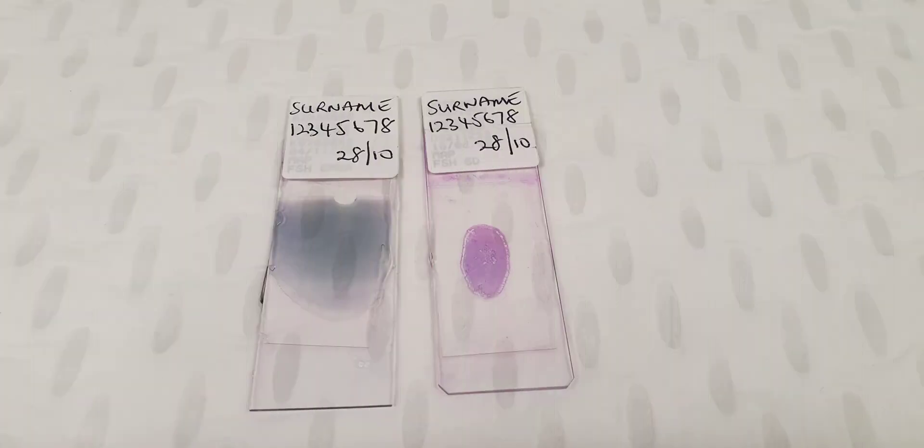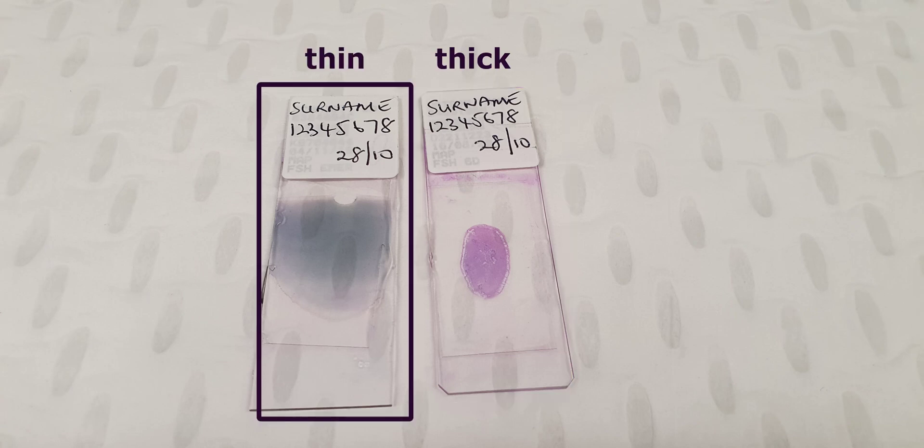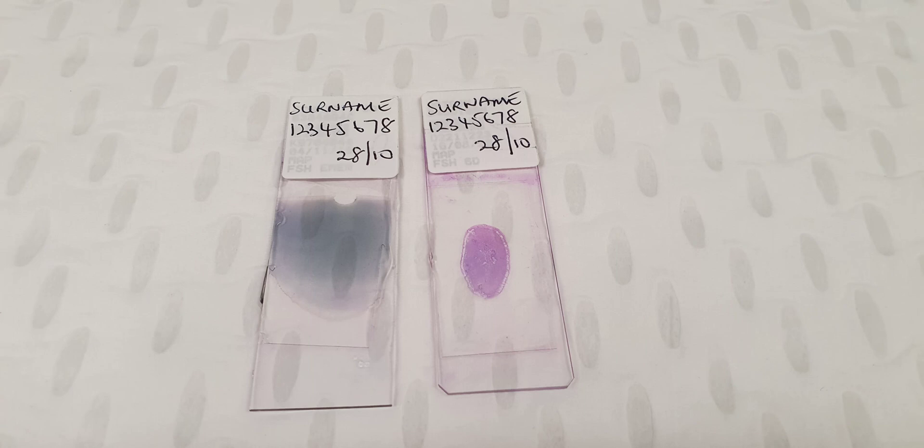For malaria, it is standard to prepare both thick and thin films. The thick film is essentially a screening test. By concentrating the blood, we can pick up parasites at a lower density. The thin film, on the other hand, is to identify the species of parasite.